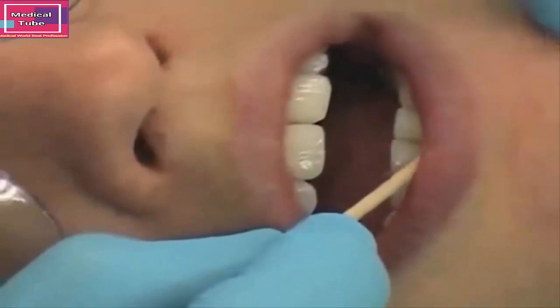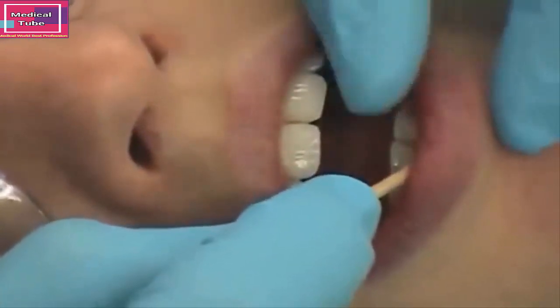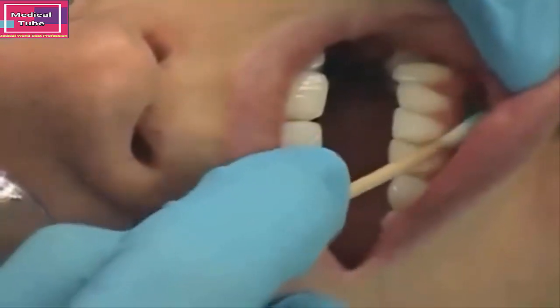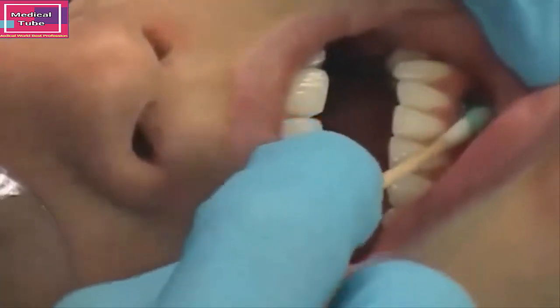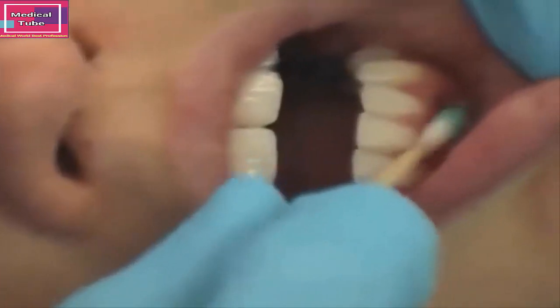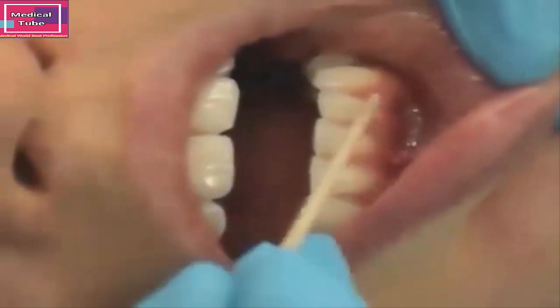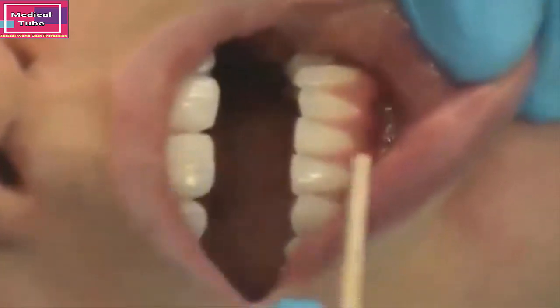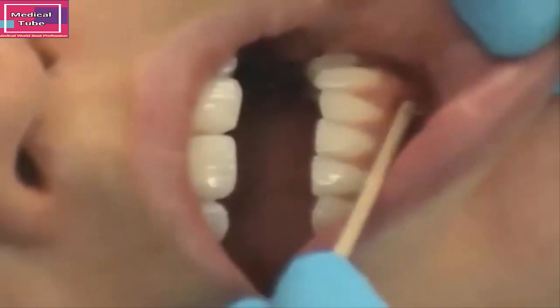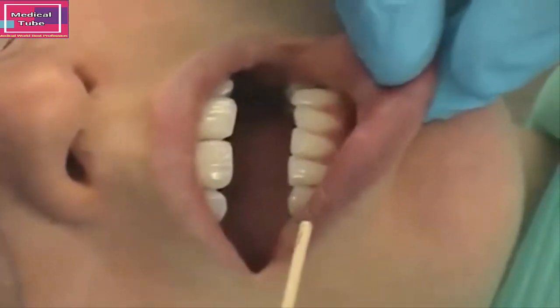For the needle gauge and length, we're going to use a 25 or 27 short needle. The patient position is going to be supine. The operator position is going to depend on the area. The landmarks for the maxillary and mandibular is the mucobuccal fold, parallel to the root, close to the bone and apex over the tooth. For the mandibular only, you're going to use the junction of the lingual attached gingiva and the floor of the mouth parallel to the tooth axis, near the target tooth and close to the bone.